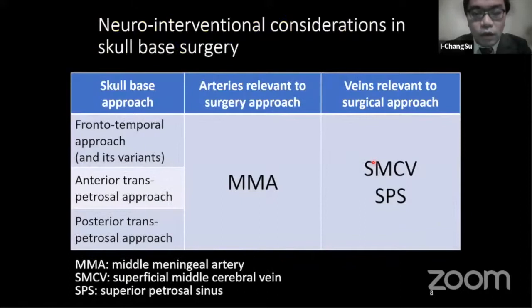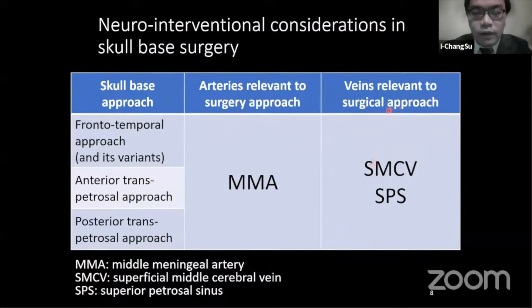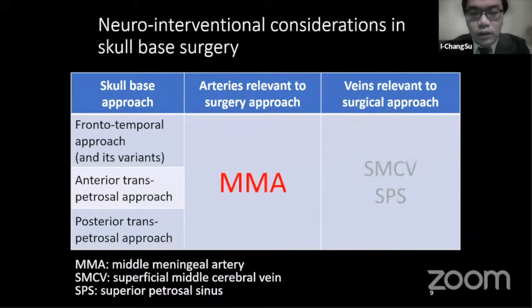We will focus on three classical skull-based approaches, including frontal temporal, anterior transpetrosal, and posterior transpetrosal approaches. The vessels that are relevant to these approaches are the middle meningeal artery, superficial middle cerebral vein, and superior petrosal sinus. Let's start from the middle meningeal artery.